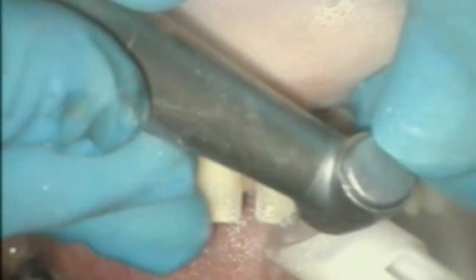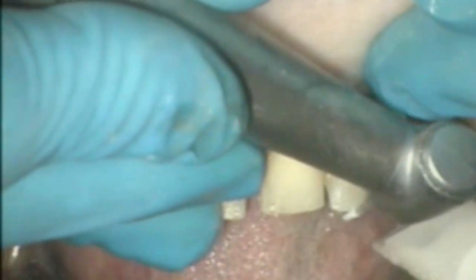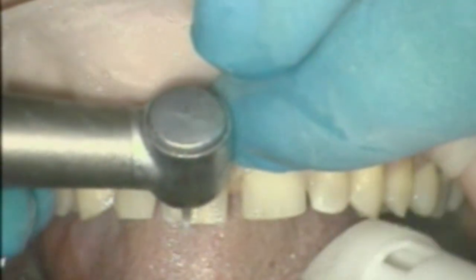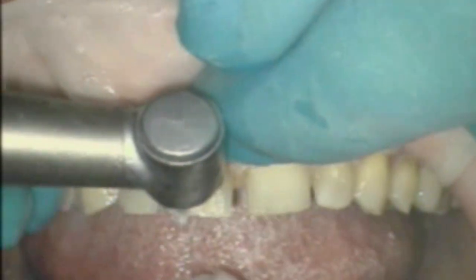Not obstructing his view. You see, that's my air water, giving little short blasts of water, keeping it clean, keeping his handpiece clean. You say, Shannon, really, you're keeping the handpiece clean? Yeah, I am. I want the burr to be clean. I want the handpiece to be clean. And most importantly, keeping the little tooth dust off the patient's tongue. Because that's my job, is for everything to be perfect, clean, and clear.